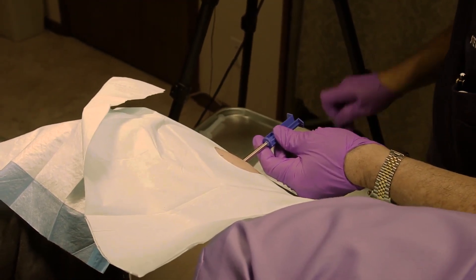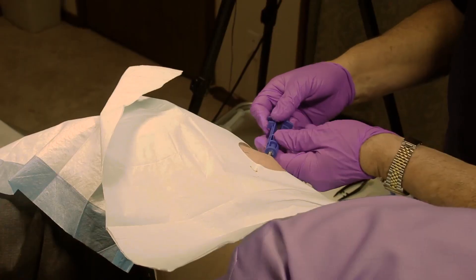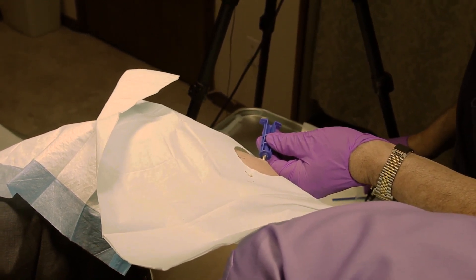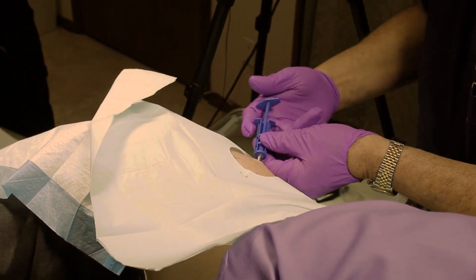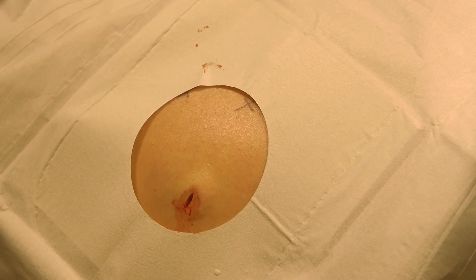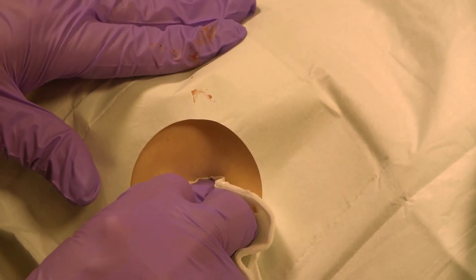Now I'm going to put this device back in. Okay, we're going to aim towards the other track and repeat the same procedure. In this patient we're using just two tracks. Some patients getting more pellets may actually require a third track in the middle. We repeat the same procedure, gently pushing in as we're advancing the introducer out, and we just gently pull it out. Hopefully the patient won't have any significant bleeding, but in men, since you're tending to go a little more into the muscle, you may have a little bleeding and may want to put a little pressure on for a few minutes.